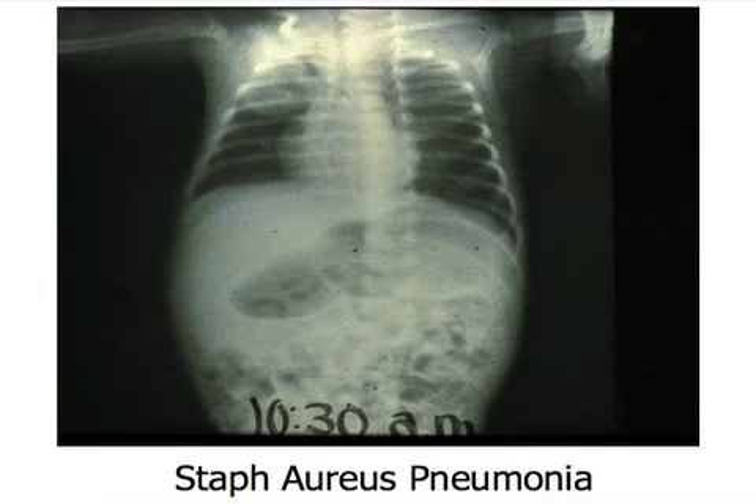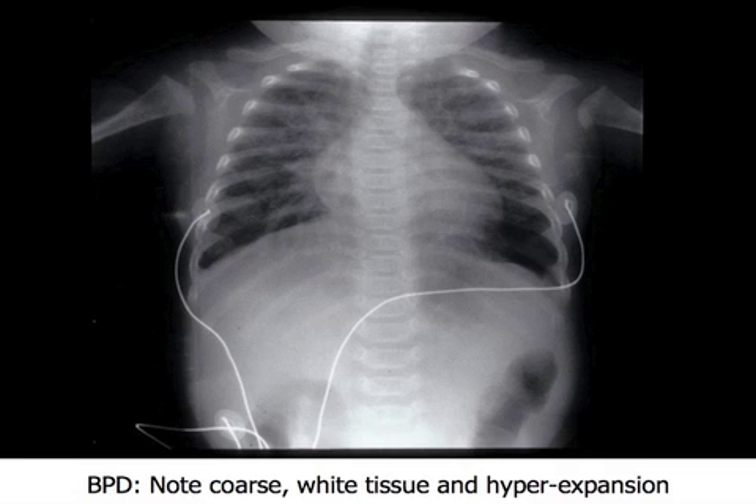Now let's look at the rest of the X-ray. He's severely reticulated. Doesn't have any type of lines in it — got plenty of air. This is BPD: Bronchopulmonary Dysplasia. It's not called BPD by many people now; it's usually called chronic lung disease. There's a new BPD and an old BPD.